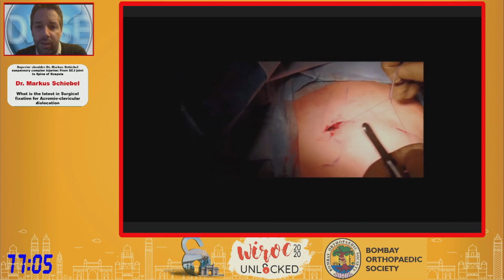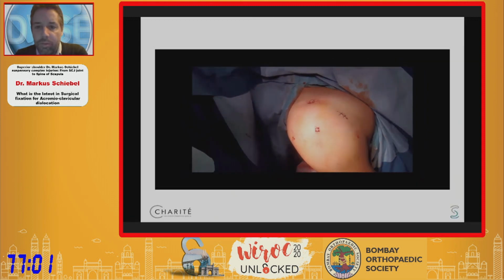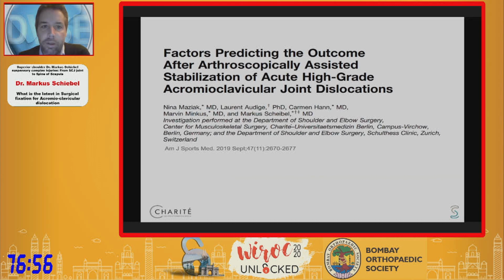So it's a very minimally invasive technique, and obviously it's something that you might call internal bracing, because we don't reconstruct any ligaments, but that's the technique we are currently doing. One last study I would like to show you.